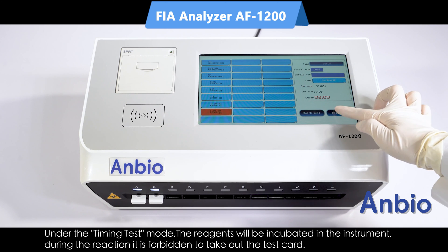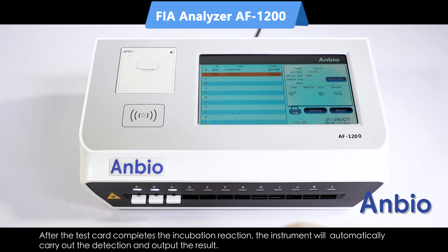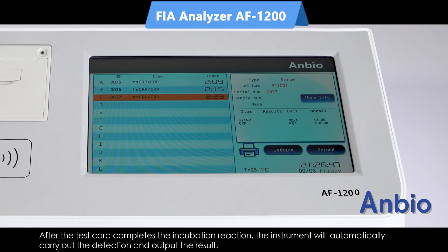Under the timing test mode, the reagents will be incubated in the instrument. During the reaction, it is forbidden to take out the test card. After the test card completes the incubation reaction, the instrument will automatically carry out the detection and output the result.